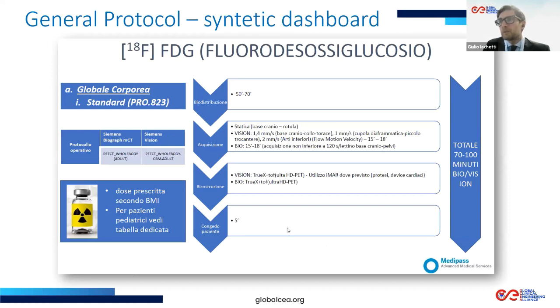This is a real tool. This is in Italian because I wanted to show you a real tool. This is an attachment of a protocol. How can we set a protocol? Obviously, a diagnostic protocol. You always have to indicate the protocol with a code.